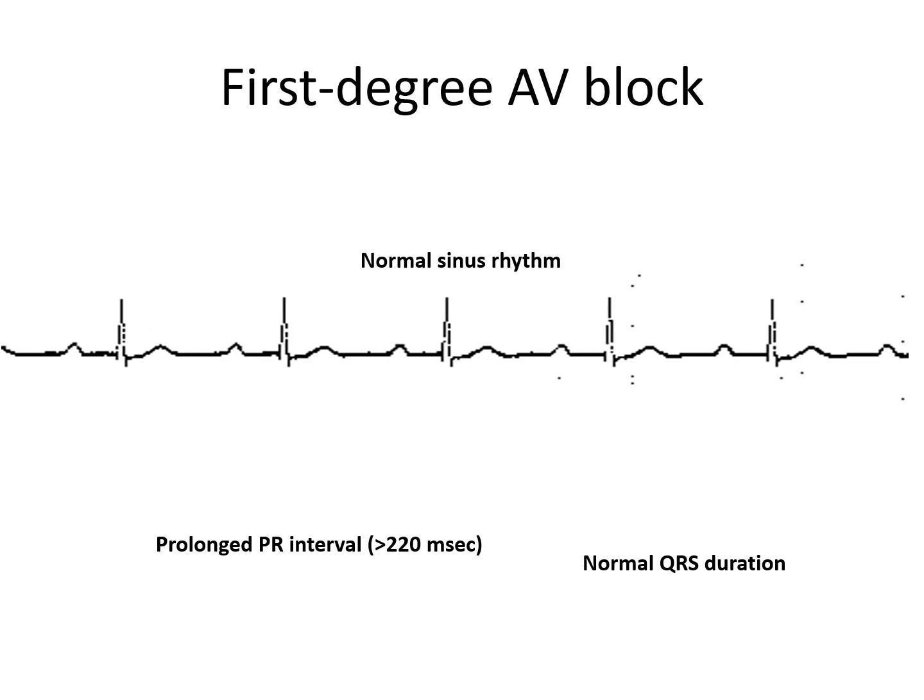First degree atrioventricular block: normal sinus rhythm, normal QRS complex but prolonged PR interval.